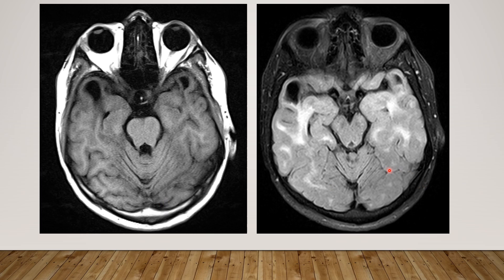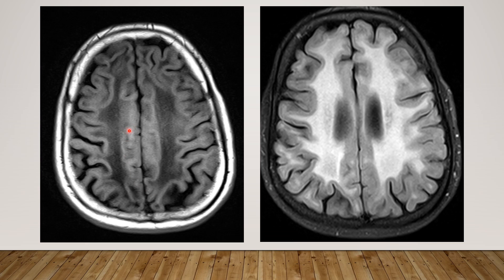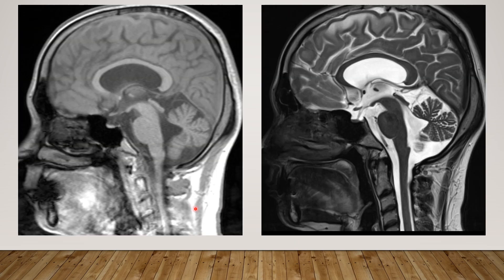The visualized cerebellum appears normal. Again, there are subcortical cysts in bilateral anterior frontal regions. The T1 and FLAIR images show diffuse white matter changes. Here are the sagittal T1 and T2-weighted images. The corpus callosum is normal, the cerebellum is normal, and the brain stem is normal.